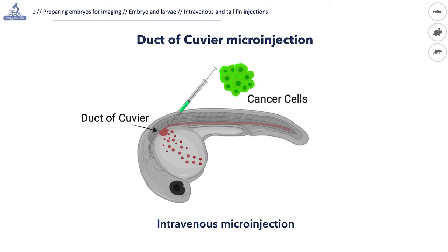The first microinjection method that we will demonstrate is injection into the blood circulation. We perform this using two-days-old embryos. The site of injection is the common cardinal vein, also known as the duct of Couvier. This is a vein that returns blood to the heart, and from here the injected sample can be delivered over the whole body through the blood flux.